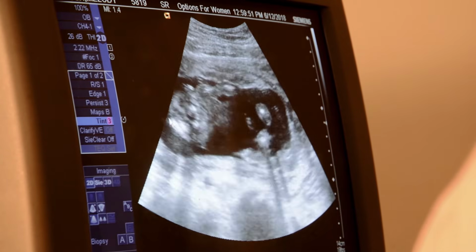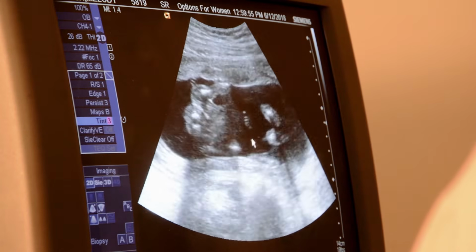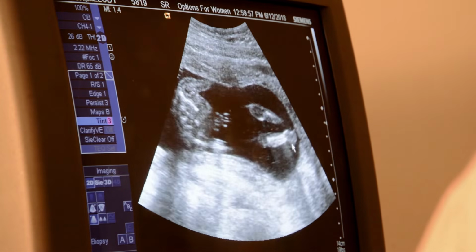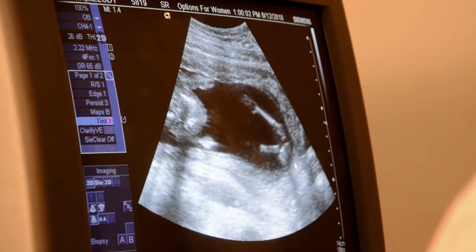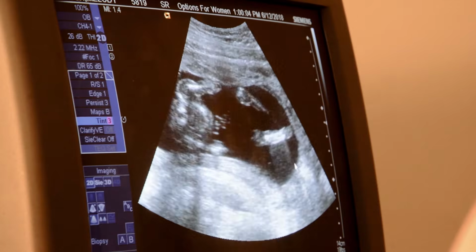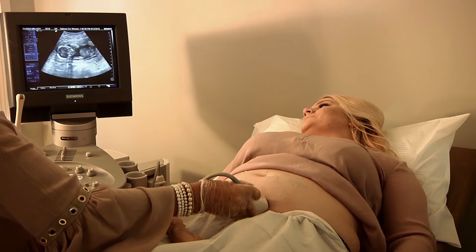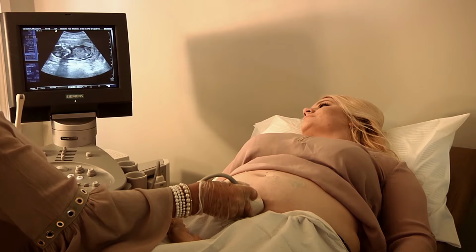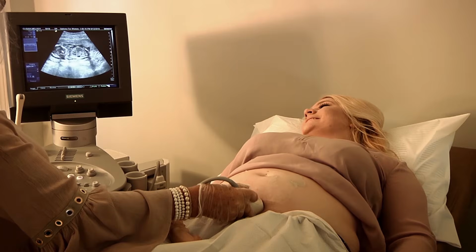So here he is. Can you feel that, Mom? A little bit, yeah. He's kicking. There's his feet. Kicker, kicker, kicker. Give her a kick. See her 2 feet. There's the heart. Are you going to hold still for a minute while I get that heart?